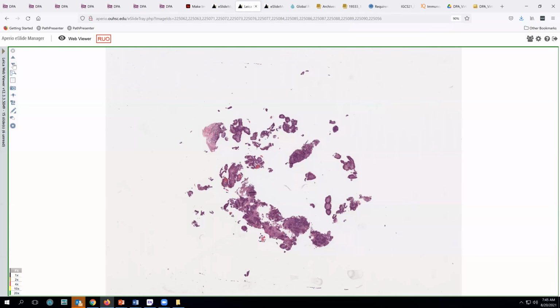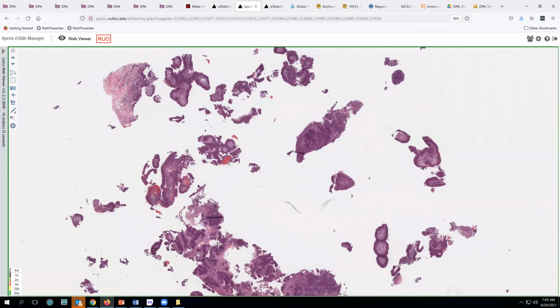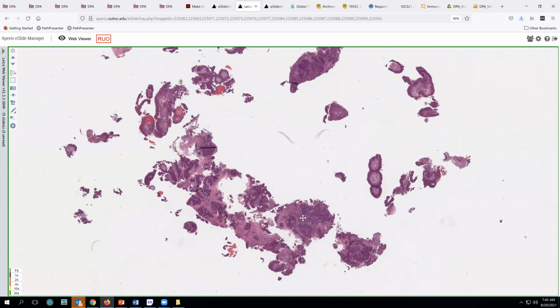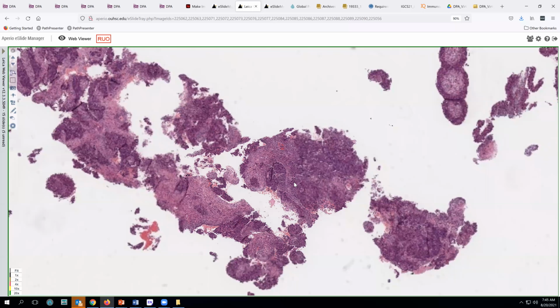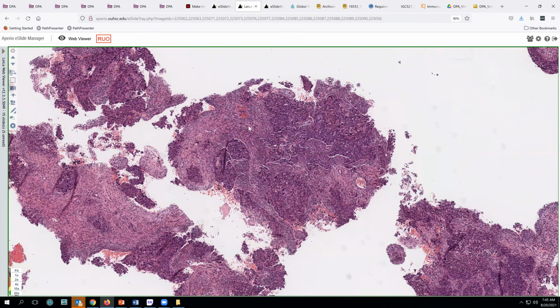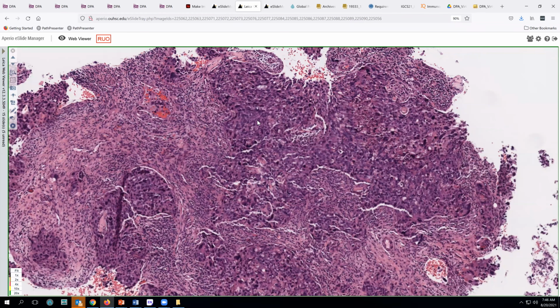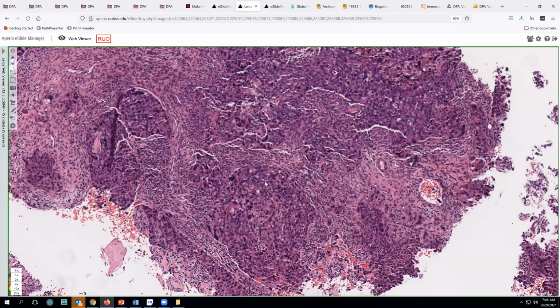All right, well, let's shift gears again. This is a younger patient in her early 40s who has developed a breast mass. And there is a family history in this patient as well. So ultrasound examination showed a very high risk lesion, and these biopsies were obtained. And so this is kind of the other end of the spectrum compared to what we just looked at. Here's solid tumor growth, a lot of sclerosis, really not much in the way of glandular differentiation that we can see anywhere in this tumor.